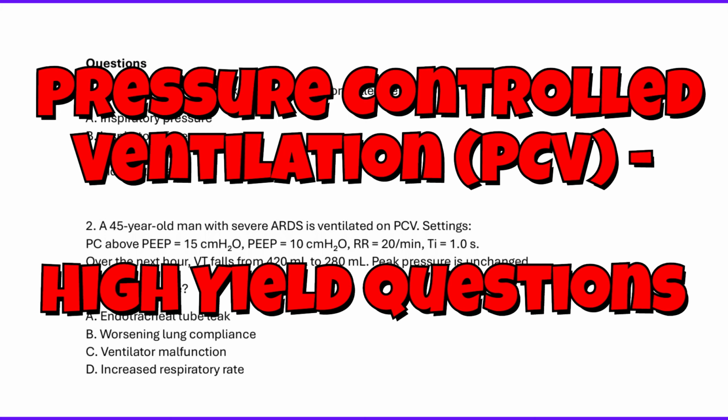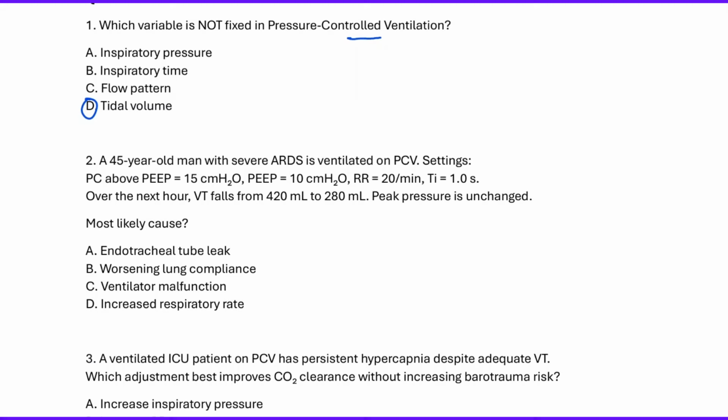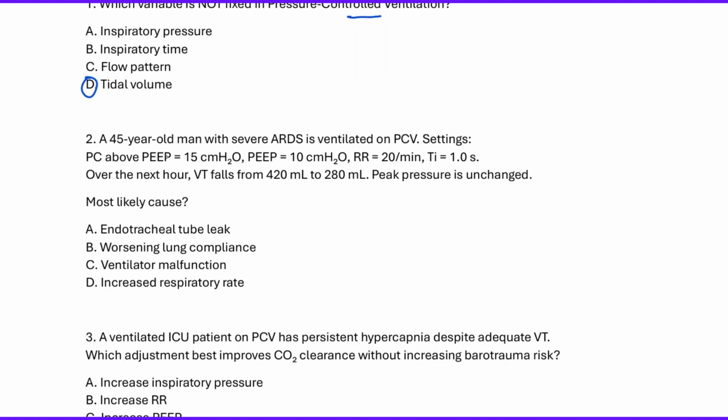So the first question there, which variable is not fixed in pressure control ventilation? Remember, our tidal volume is not fixed, it's variable. Next question, a 45-year-old man with severe ARDS is ventilated on pressure controlled ventilation.